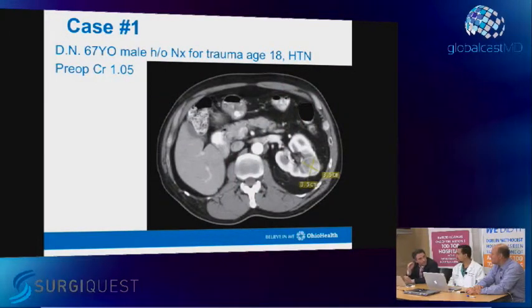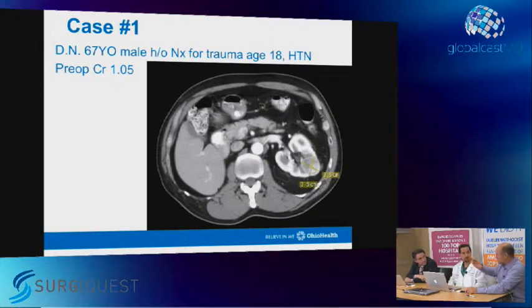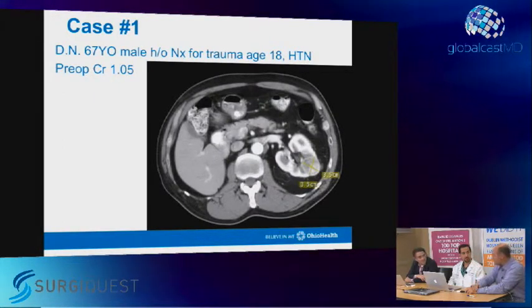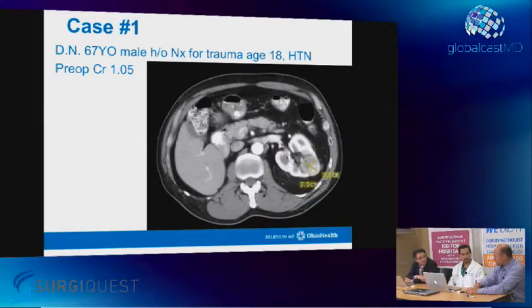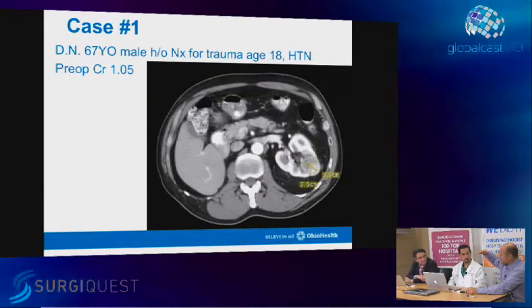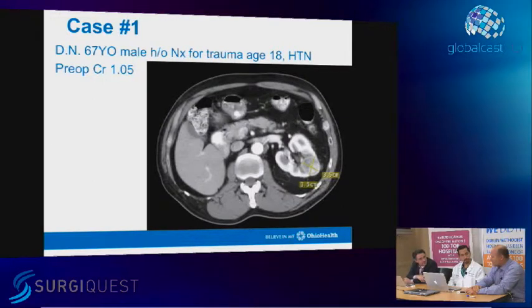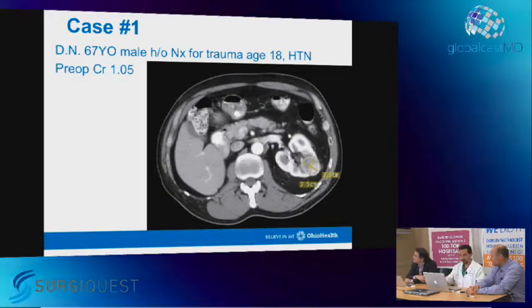What do you use as your cutoff between when you go retro versus trans? That's a very good question. I tend to do lateral tumors retroperitoneally, and the way I come in is pretty much right in line with this tumor, so I would probably do this one retroperitoneally. I do medial tumors and anterior tumors transperitoneally. I use the lateral line as a cutoff, but I tend to shift things a little more anterior because of the angle we're able to approach it. So you would err on the side of retro? Yeah, it's about 60-40 retro-trans, but close to 50-50 in a lot of cases.